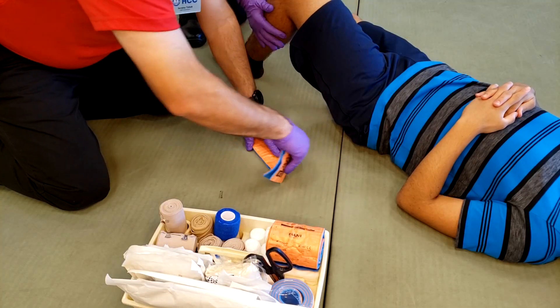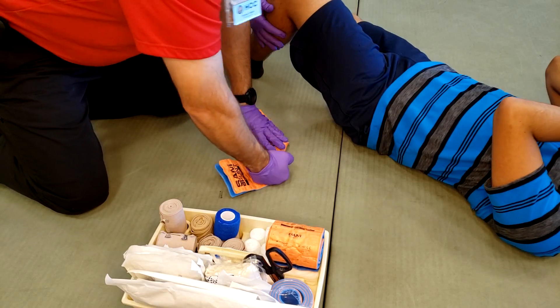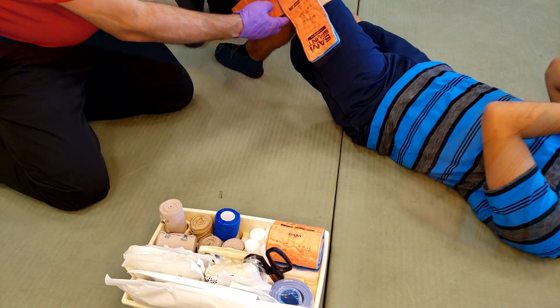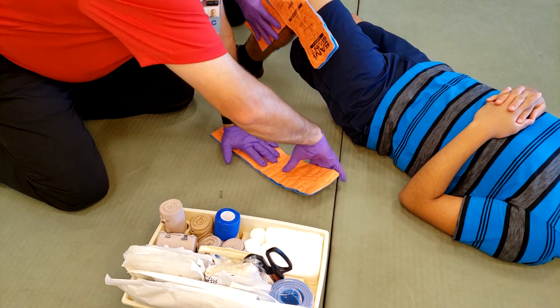Deploy the Sam Splint, fold it, and measure it for proper fitting. Note that you will need two Sam Splints to accomplish this method.